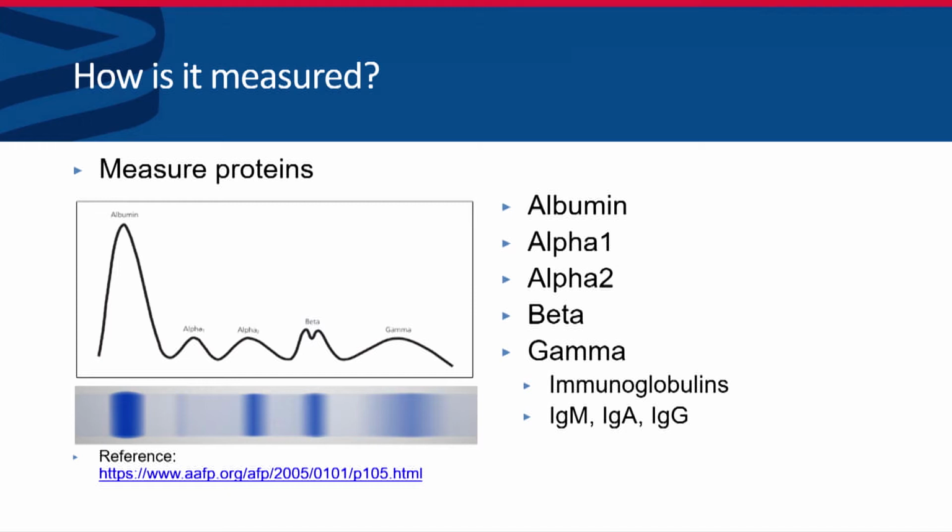So this is something only scientists will really see. Nothing for you to worry about, but it will just explain what we do. We measure proteins. That's what serum electrophoresis is. The biggest protein in blood is albumin. That's the biggest band there down the bottom that you'll see on the left-hand side. You get that on every chemistry test. You'll do albumin. We do it better than looking at this big band. But on chemistry, this is albumin.